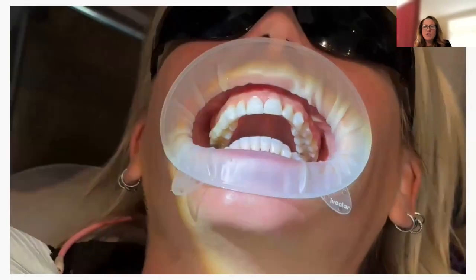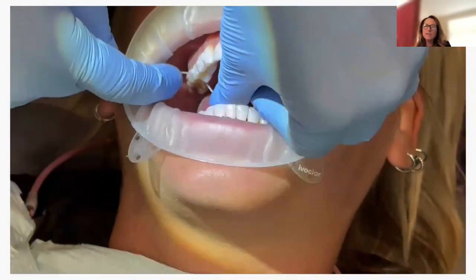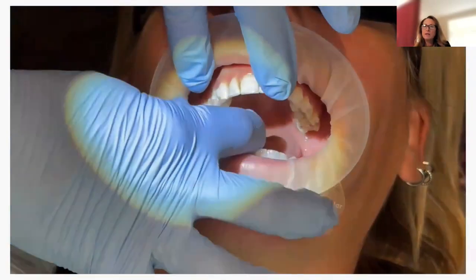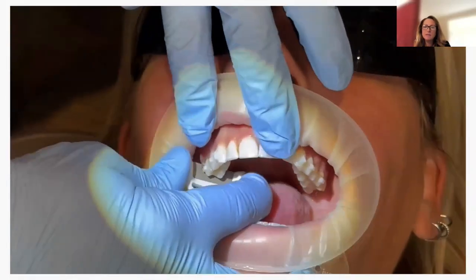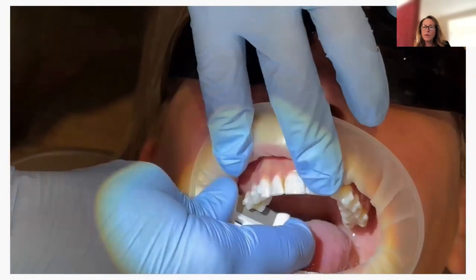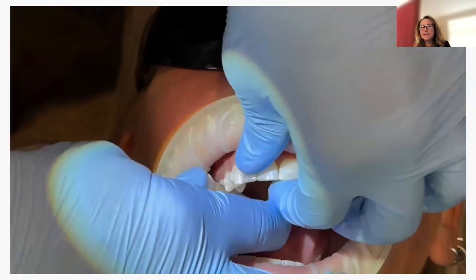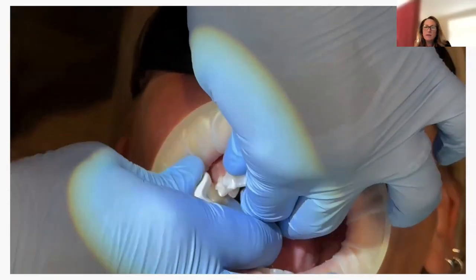So he didn't have a gauge, but first of all, you want to floss. If there is resistance, then you know those are the areas that need IPR. Start off with the finer diamond disc and work your way up if needed. And this one has a single edge, single-sided. You can get these in double-sided.